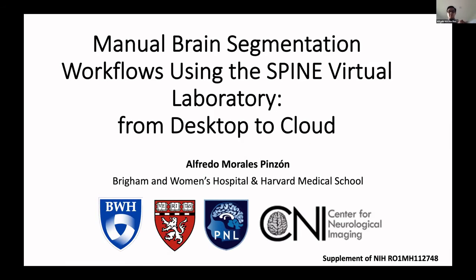It is about brain segmentation. So one of the topics I was presented at the beginning. And the idea is to have these brain segmentation workflows migrated from desktop application to cloud applications. And here's the supplement of this parent grant.